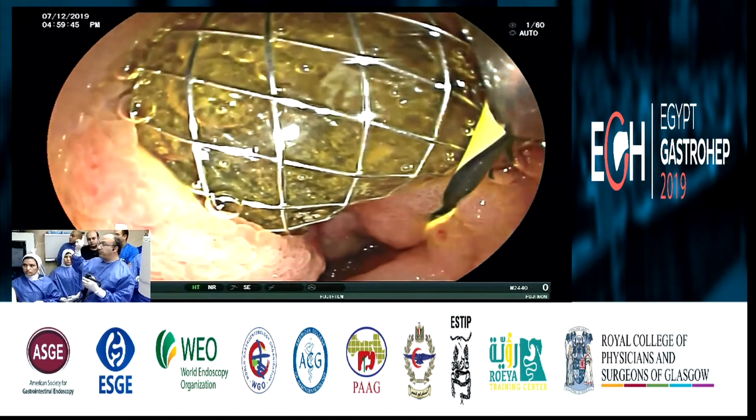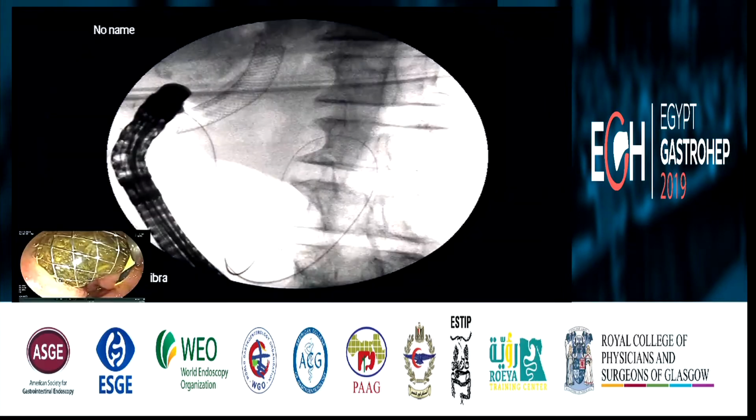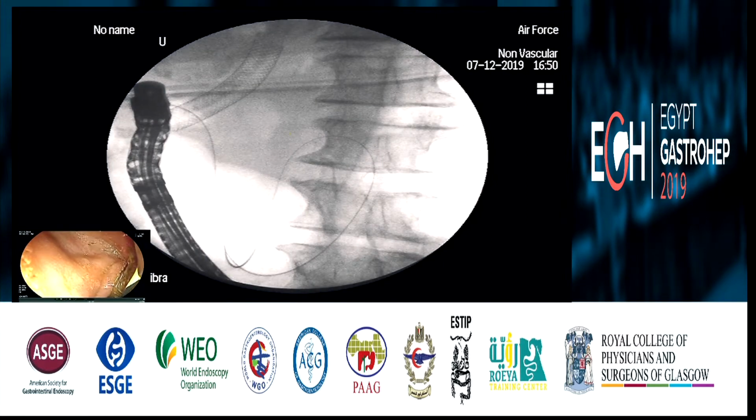So can we have fluoro, please? Can we have the screen? So you see the tip of my endoscope. This is a duodenoscope in the bulb, right where the choledochoduodenostomy is. I can go a little bit backward. So you see this is the bulb. This is the pylorus, right? We're in the stomach. I go across the pylorus and come to the apex of the bulb. There is the choledochoduodenostomy. Then I have the lumen of the duodenum with a standard 0.035 guide wire, a standard ERCP wire, and I'm going to ask Salma to pull on the guide wire while I push a 7 French nasobiliary catheter.